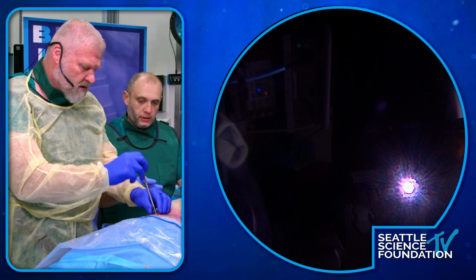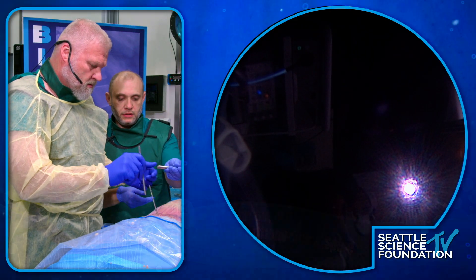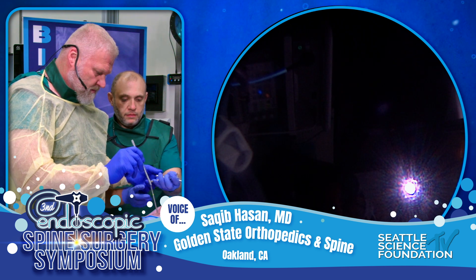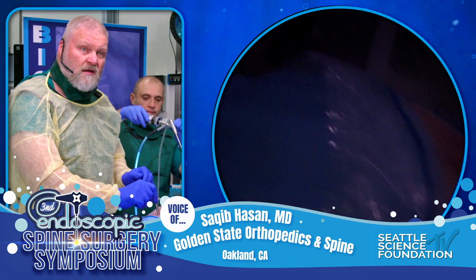Okay, swap around. Ray, in the interest of time I know it's going to be tough to take all the flavam off, but maybe you can just show an example of both uses.